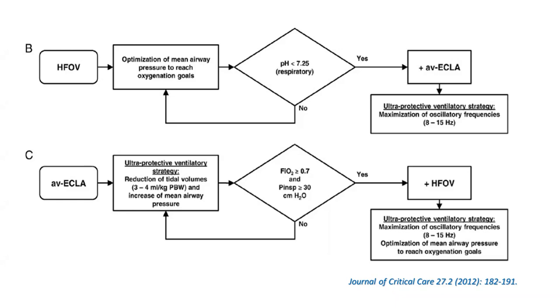Basically, in terms of optimal PEEP, we utilize less optimal PEEP in cardiac ICU, in my opinion. The worry is the higher PVR situation.